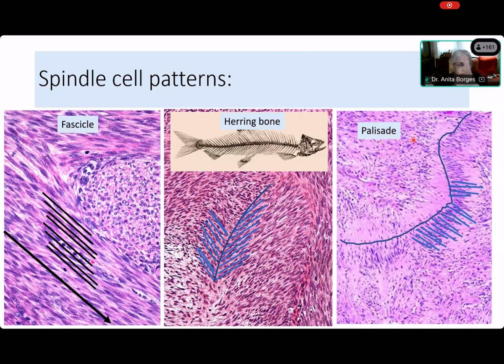And apart from spindle cells, Elsa, do you see a palisade in any other cell? Can other cells form a palisade? Yeah, Elsa? No? Okay, let's ask Chandana. Chandana, do you know of any other cells that can form a palisade? Saif Ali says that basal cell carcinoma forms a palisade. Everybody's talking about basal cell carcinoma. Do you agree, Elsa? Yes, ma'am. Basal cell carcinoma does palisading of cells. Where? It's peripheral palisading. Peripheral palisading. Is there anything that is not peripheral and can form a palisade?